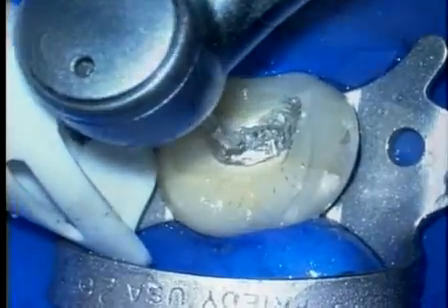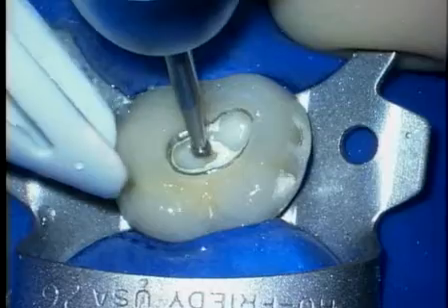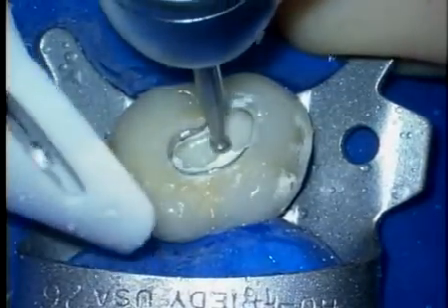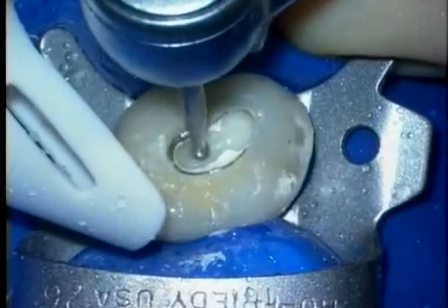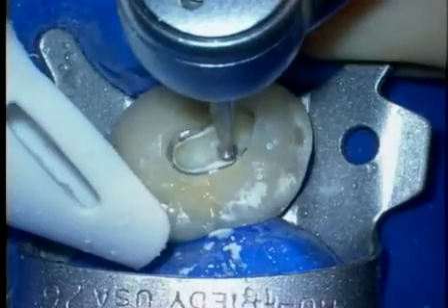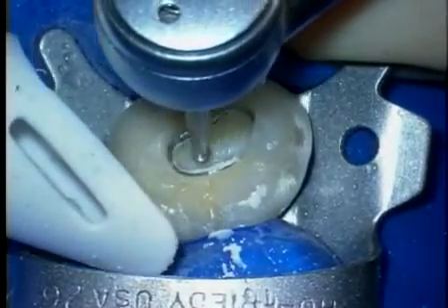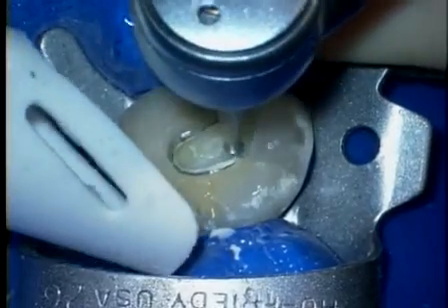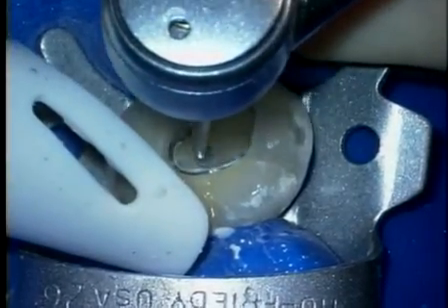The transmetal burr is laid over on the side, as we've previously mentioned, and it's now cutting on its side. Once we've penetrated through the metal, we go to the surgical length carbide number 4. Again, notice the line of sight down the shaft of the burr. We can always watch the rotating head cut, and we're using that head like a brush, painting buccolingual and mesial to distal as we progressively move closer and closer to the roof of the pulp chamber.